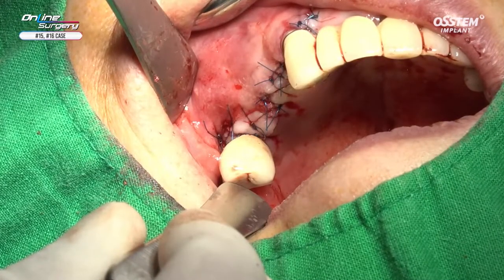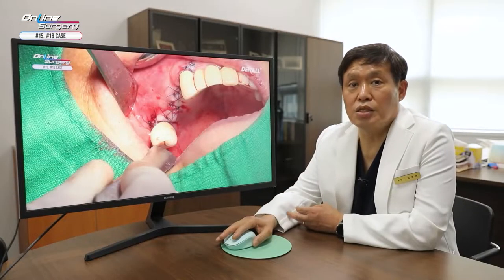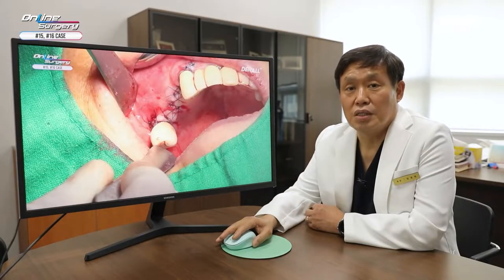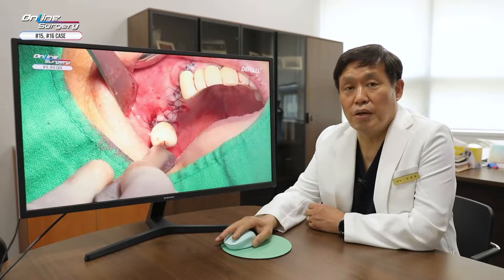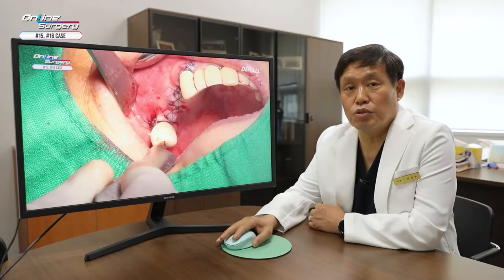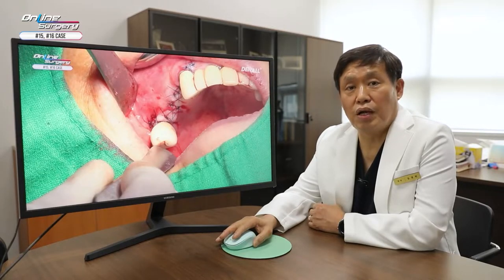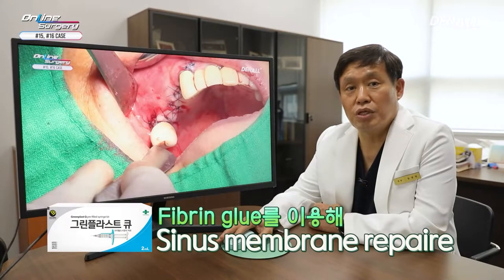Suture is complete. In the surgical clip shown, I used the LASKIT to form the lateral bone window. As seen in the video before surgery, sinus membrane thickening was observed in those cases. Because there's pathology at times, there can be perforation. When there's sinus membrane perforation — as already mentioned in a previous lecture — you can use fibrin glue for repair.